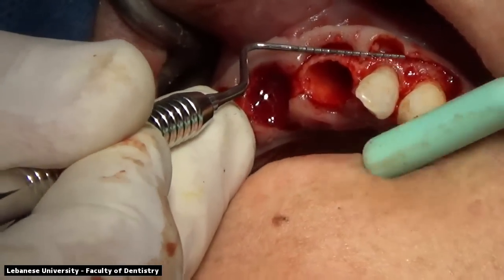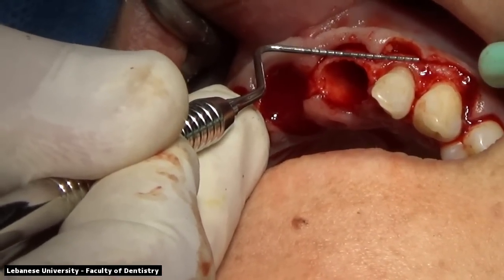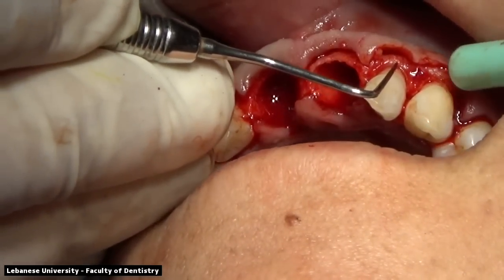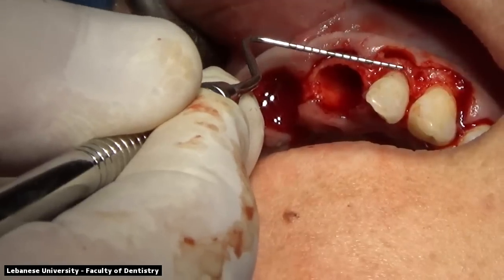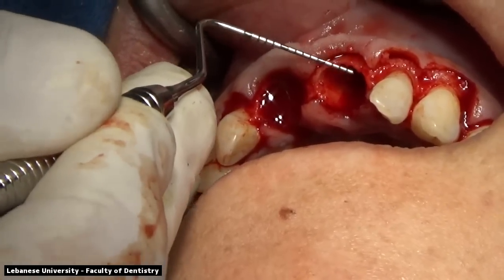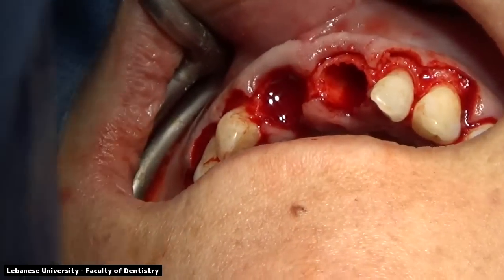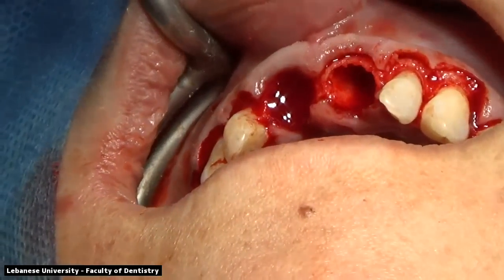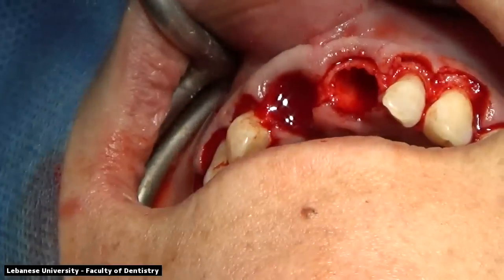We want to see the levels of the bone on the centrals with respect to the lateral incisor and the cementoenamel junction of the neighboring teeth. We are almost 2.5 millimeters away from the cementoenamel junction of the neighboring tooth. And the implant will be placed directly on the bone level that is present at this point. So the level of the bone, which is 2.5 millimeters away from the cementoenamel junction on the neighboring lateral incisor, that is where the level of the implant will be.